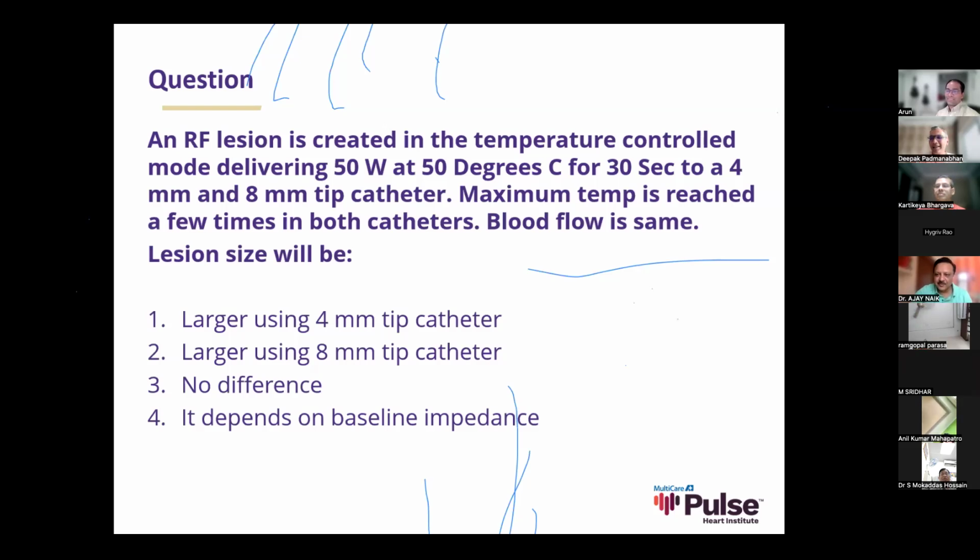It's almost like the speed breakers in India, where you have the elevation and the dip. So the tip of the dumbbell where the waist is would go into the depth, and the bulge would sit on the tip. And so you could maintain your contact across, thereby delivering that lesion. Now, I think ICE has made it much easier, but yeah, I would imagine that would have been the case.